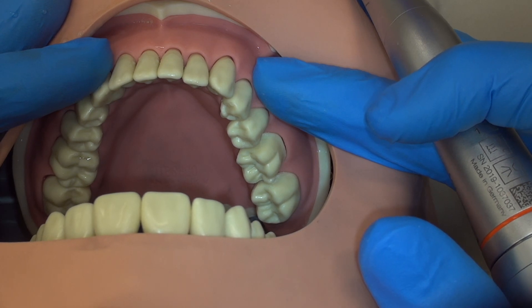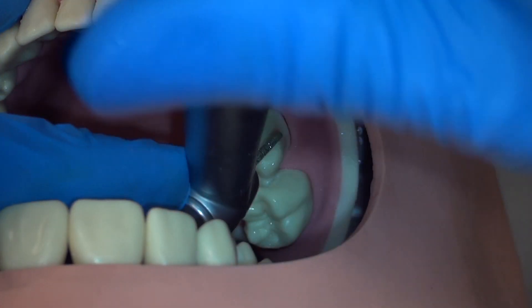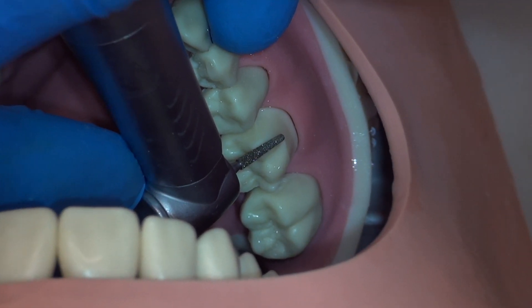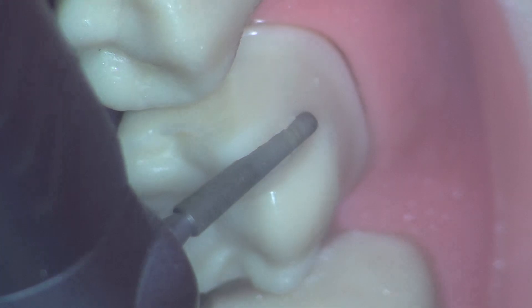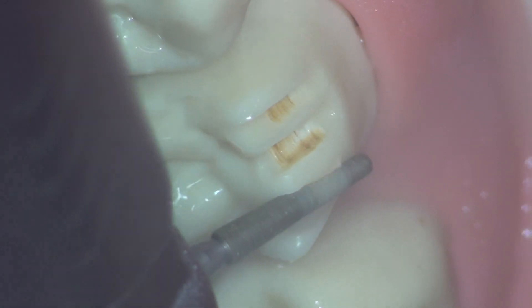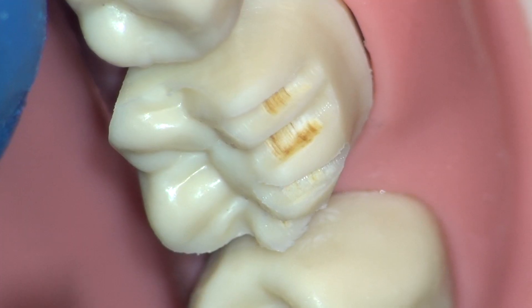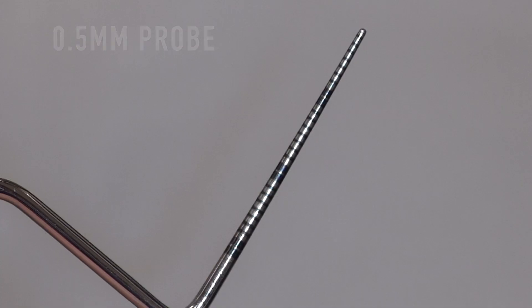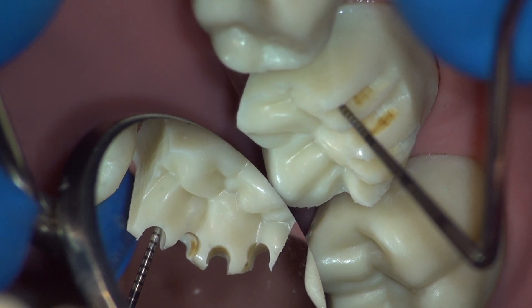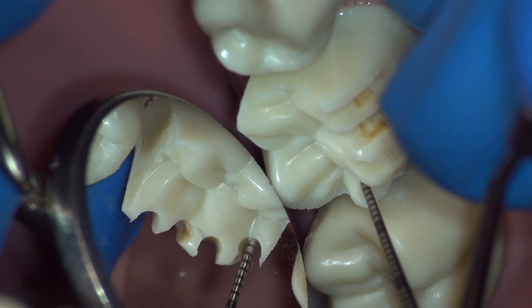The next step is occlusal reduction using a direct view. We begin using a coarse modified shoulder. The handpiece can be rotated to approach from the anterior to provide access and visibility. Note the left hand stabilizing the handpiece. We begin by placing depth grooves at the cusp tips and occlusal grooves. The burr should be parallel to the external surface of the tooth. The goal is to place these depth grooves to the final desired depth of 1.5 millimeters for the buccal and 1 millimeter for the lingual cusp. Using a 0.5 millimeter probe to evaluate: our first groove is at 1.5 millimeters, our buccal groove is only at 1 millimeter, the next is at 1.5 millimeters, and finally 1.5 millimeters.